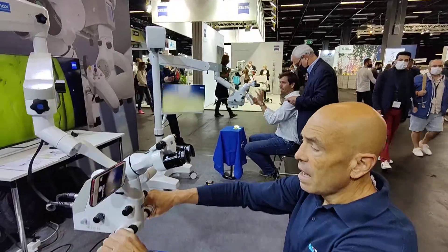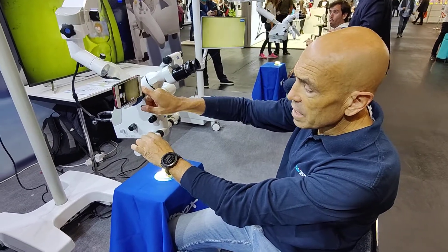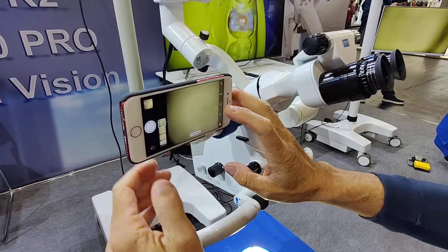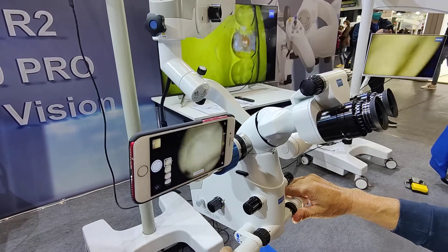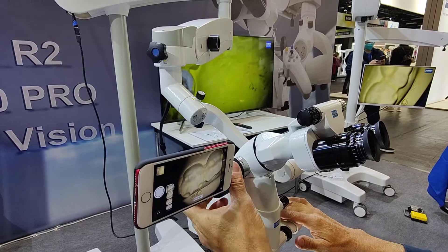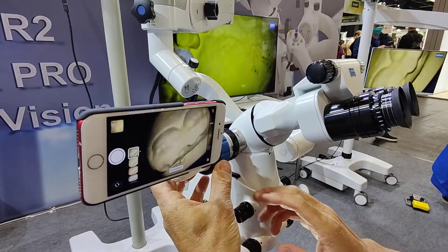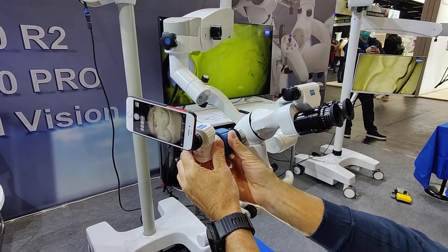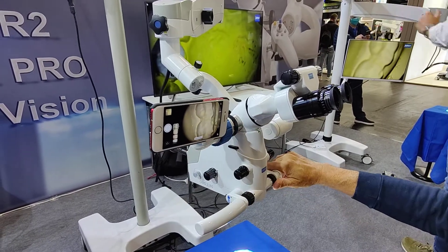As you can see here we have an extender with a beam splitter. In this case we have the phone, and the nice thing about the phone is that we can see the image on it and rotate the image to see it in different positions. This is very useful because the assistant, when she is on the other side, can rotate and see the same direction that the dentist is watching — so she can view the same thing in the same direction.